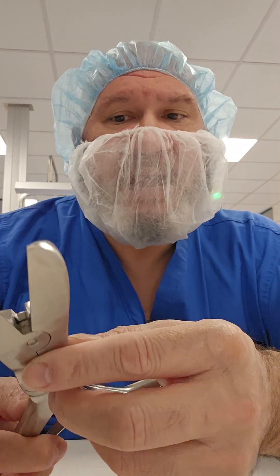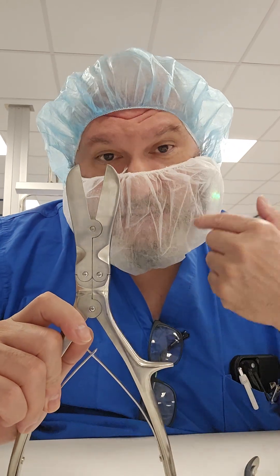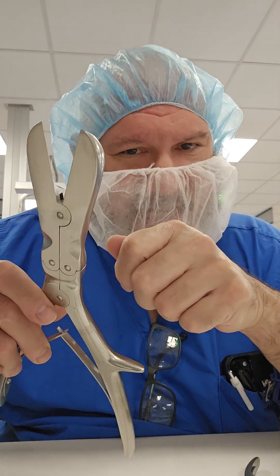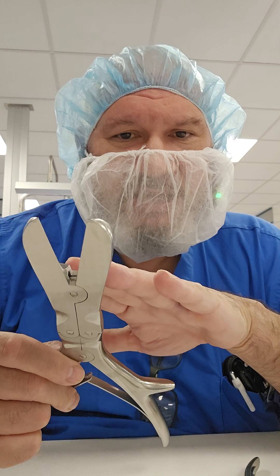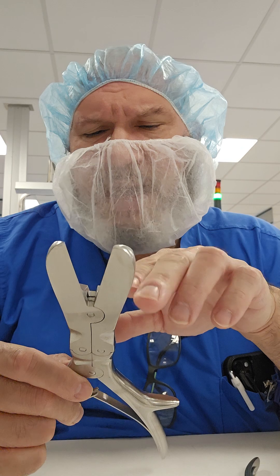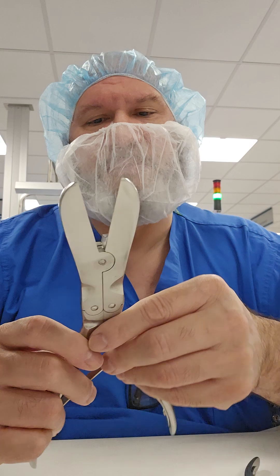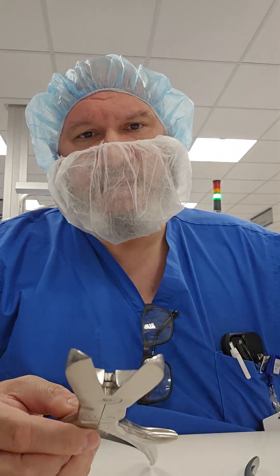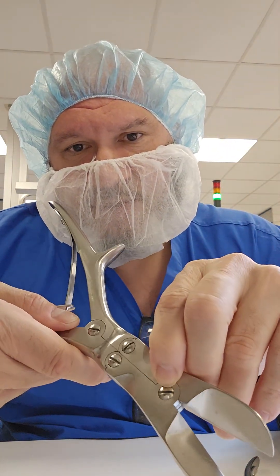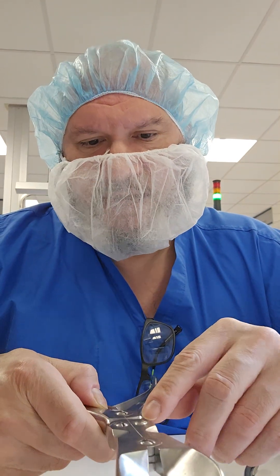If a screw is backing out and you don't notice it in the surgical field, that screw can back out into a patient. It is very tempting to tighten it yourself — do not do that. Leave it to trained professionals, as it must be tightened to a certain torque, and if it's backing out it may mean the threads are worn. Use lighted magnification for cleanliness inspection, especially around those screw indentations where bioburden can hide.